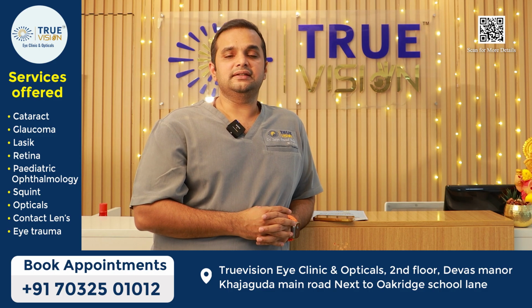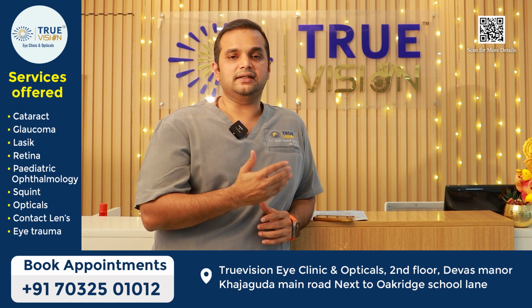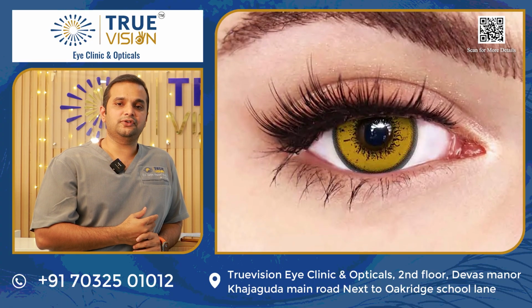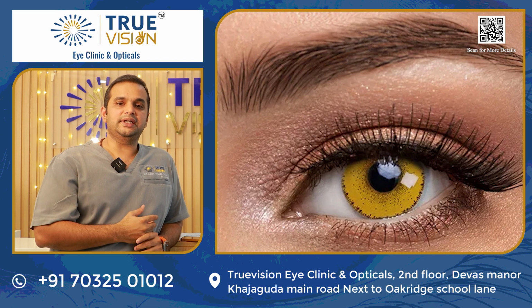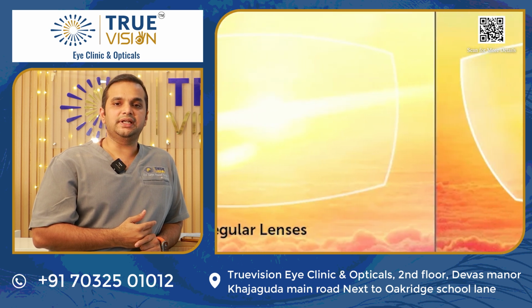Another thing about lenses here is you have different coatings also. Now, the lens is usually clear, or it comes in a yellow chromophore coating. So this yellow chromophore is coated and gives the lens a little yellow tint, because this particular chromophore protects your eyes from the UV rays of the sun.